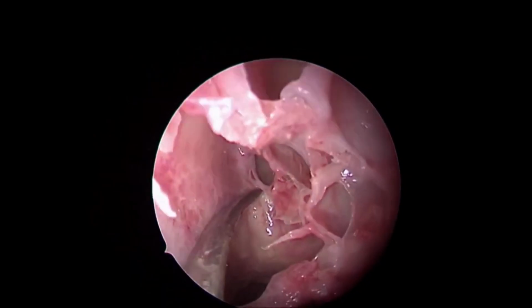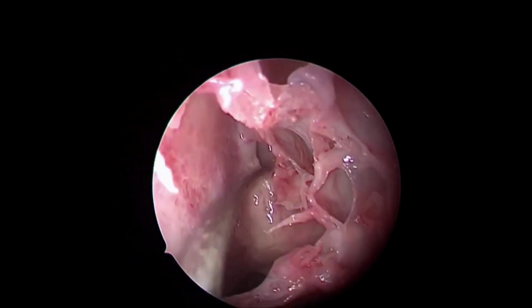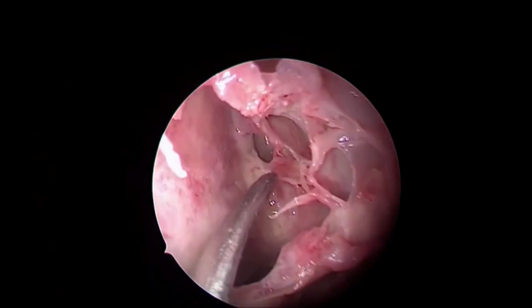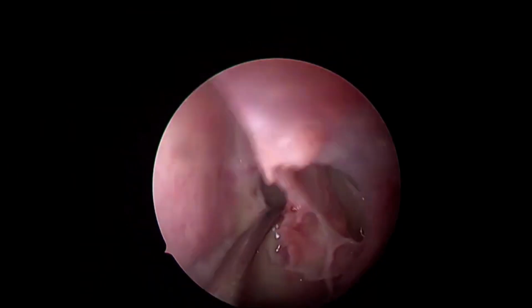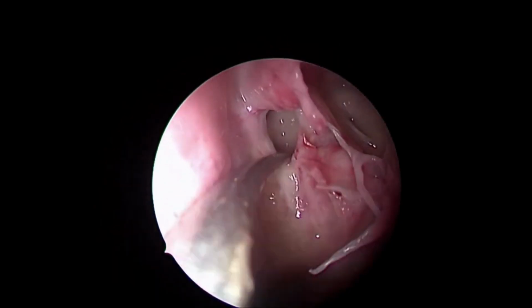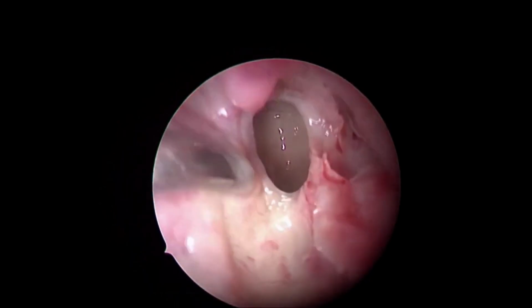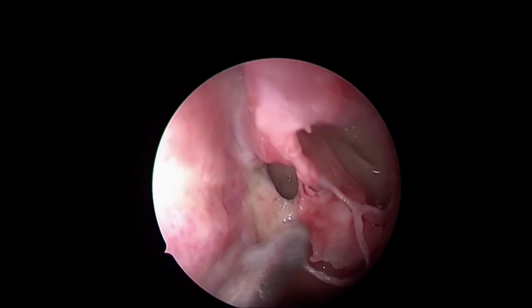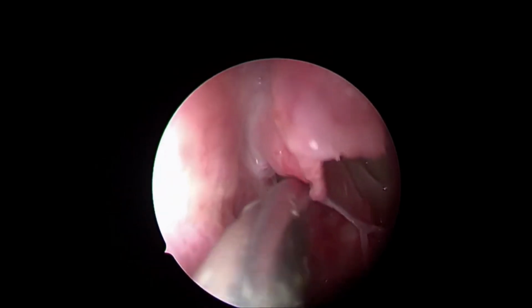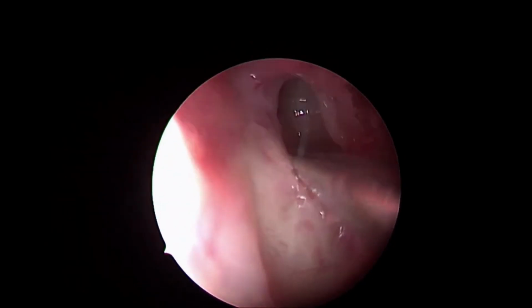When you look for the sphenoid ostium, never go above this line too much. See, this is the level of the orbital floor. Most of the time, this ostium is in the line of this floor. So the bottom line is to stay on the safer side, never to go above it, number one. And go close, flush to the septum, not flush to the turbinate. Again, you may be pushed into any cell if you go flush to the turbinate. Go flush to the septum, that will always take you into the sphenoid sinus, number one.